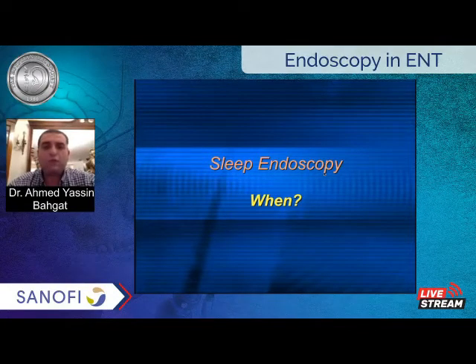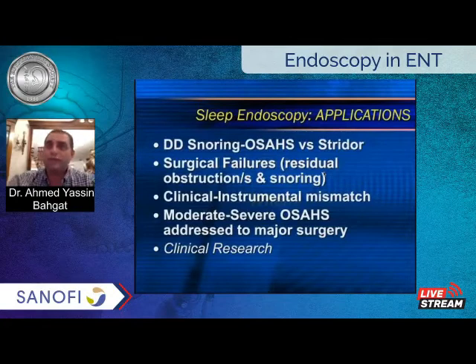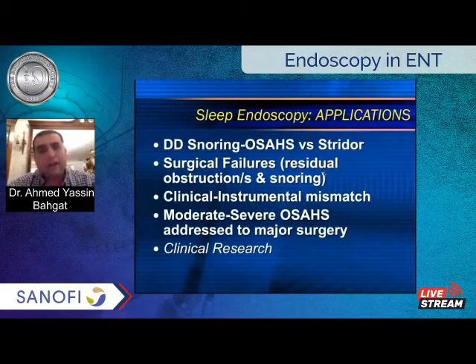But when to do sleep endoscopy as a sole procedure, take the patient to do sleep endoscopy and then return him back? If you have a vague complaint, the patient is not complaining mainly of snoring and sleep apnea, he's complaining also of stridor and different sounds during sleep, so I'm not sure what's going on. If you have surgical failures, it's very important.